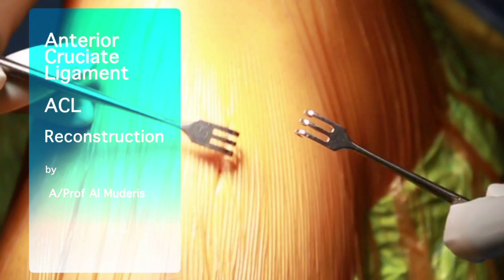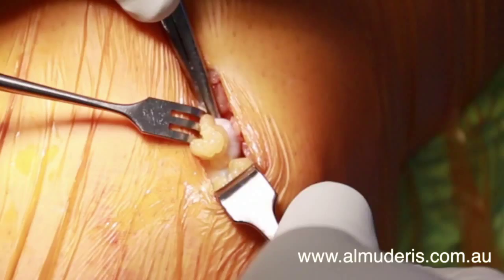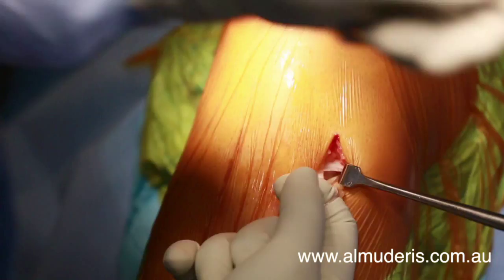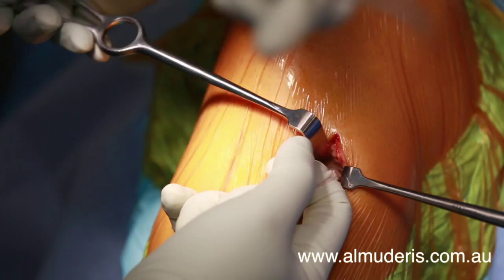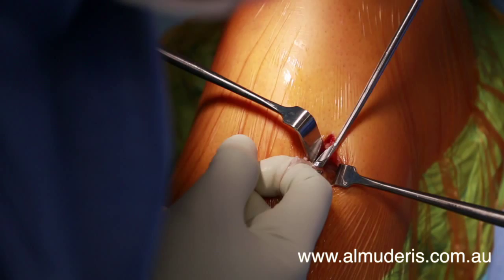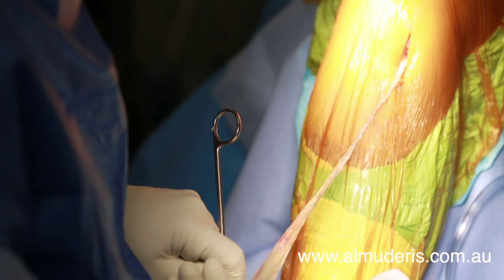The operation commences with an incision over the pes anserinus, exposing the distal insertion of the hamstring muscles. Once the semitendinosus tendon has been identified, a tendon harvester is used to liberate the tendon from the musculotendinous junction. The tendon is then cleaned of any excess muscle before it is removed from its distal insertion.